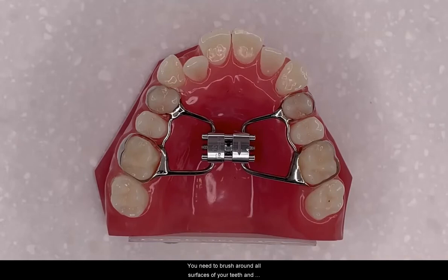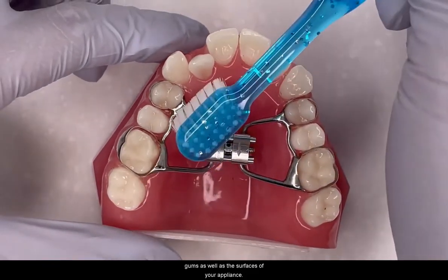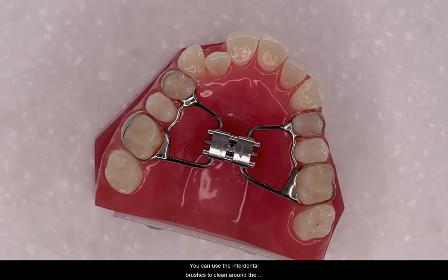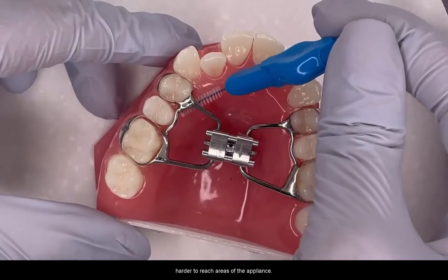You need to brush around all surfaces of your teeth and gums as well as all surfaces of your appliance. You can use the interdental brushes to clean around the harder to reach areas of the appliance.